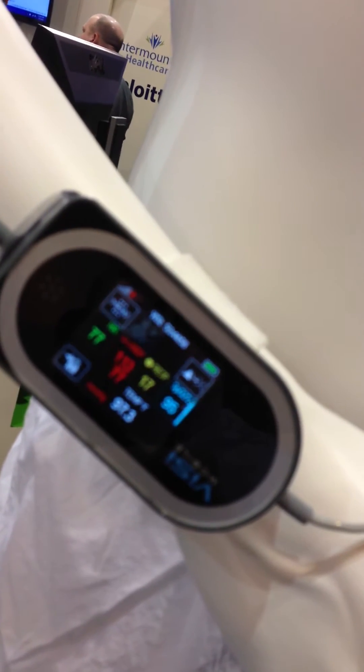This is our product, VisiMobile, which has FDA clearance since last year. We're partnering with Intermountain — that's why we're on their booth here. They're piloting our device in a post-surgical unit.